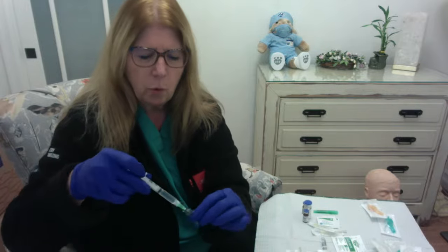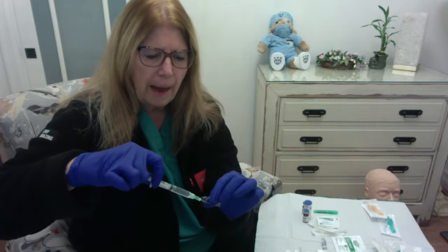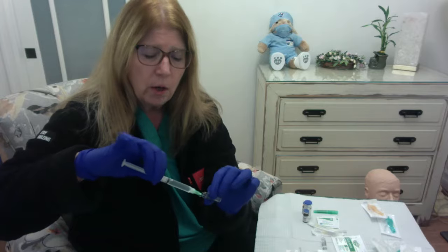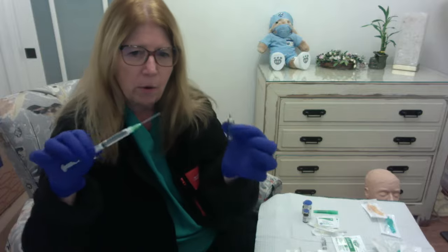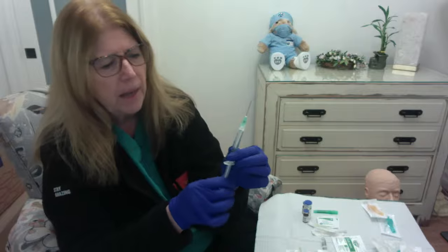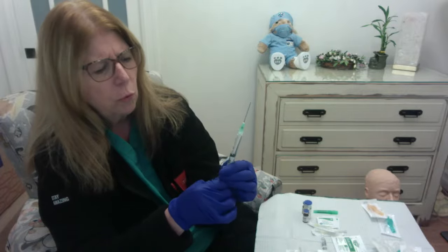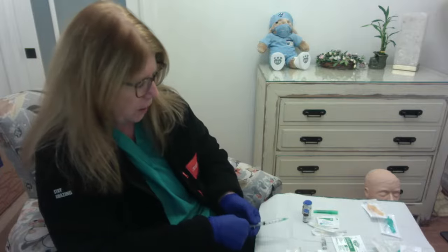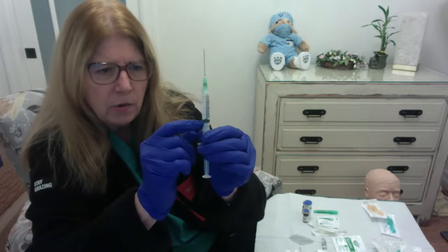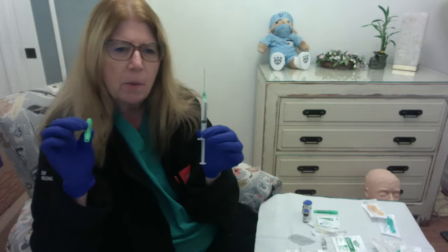As I get down towards the bottom, I need to pull back, and I can use that bevel to face it downward so that I get all the liquid out of my ampule. So I have all the liquid out of the ampule, and now I have my 2 milliliters of fluid in here. I'll just show you that top black line is up to the 2 milliliter mark. And then I could replace my cap.